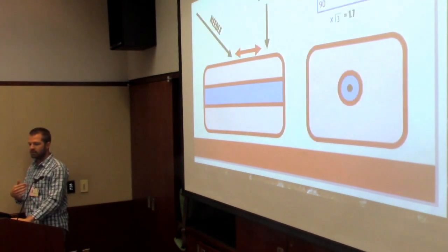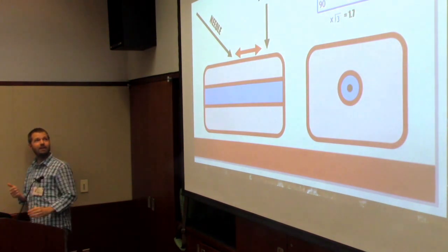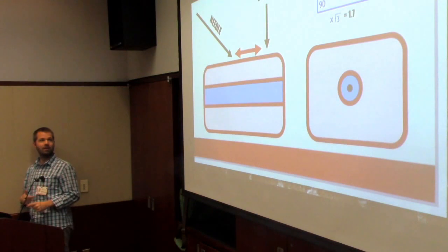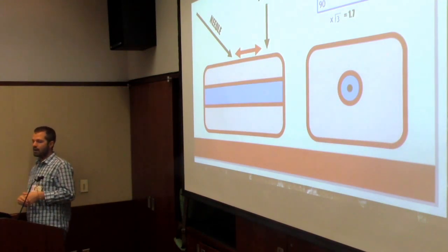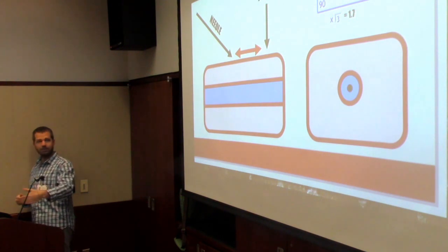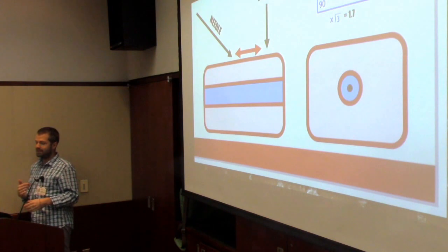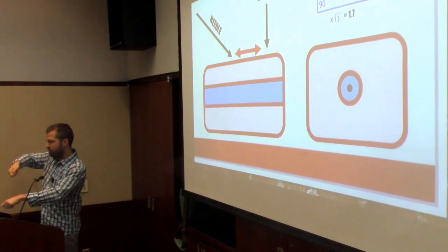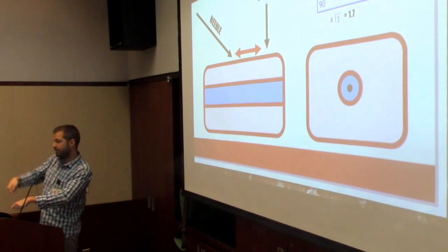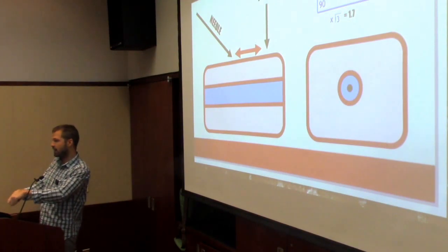They all have pros and cons at different angles. The most important angle that I think about is if I'm putting an IV or a central line or something, where I think I'm going to go about a 35 to 45 degree angle, I'm putting my probe down, I'm looking at this 2-dimensional picture, but I have to think about the other axis that I can't see. Because what I see all the time is people put an ultrasound probe down and they stab right by the probe. That's great if you're going straight down at like 85 degrees. Fantastic. You're going to see your needle right where you're stabbing in.